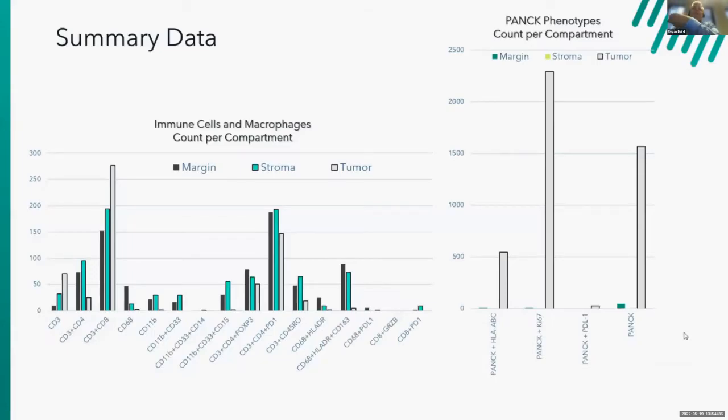This is just showing that you can plot those results. This was in Excel, so all of the data is extractable from our software. It's not locked onto our platform.